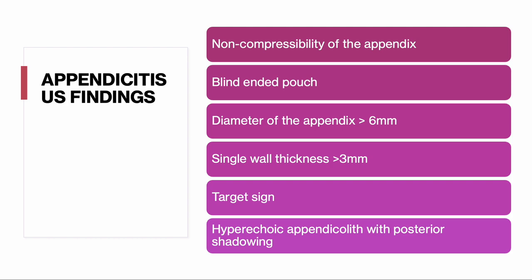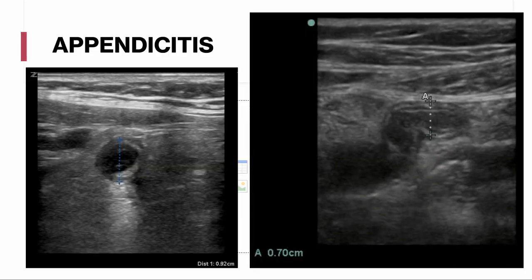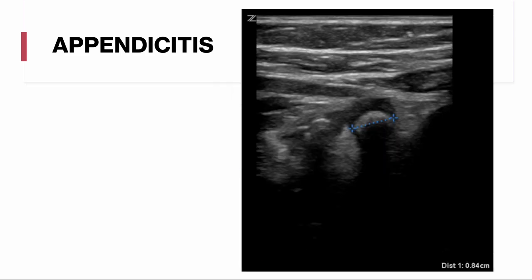Findings on ultrasound include non-compressibility of the appendix, a blind-ended pouch, a diameter over six millimeters with a single wall thickness over three millimeters. We look for the target sign, and we may see a hyperechoic appendicolith with posterior shadowing. On the left-hand side we can see a dilated appendix with diameter greater than six millimeters; on the right-hand side, a longitudinal view showing a blind-ended pouch and dilated appendix. There is also a quick image of the appendicolith demonstrating the expected posterior shadowing.